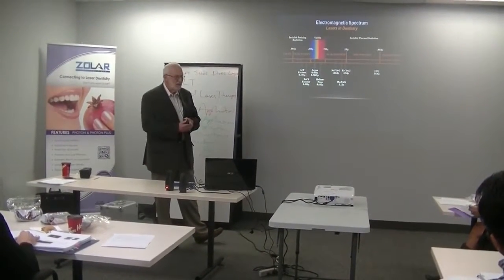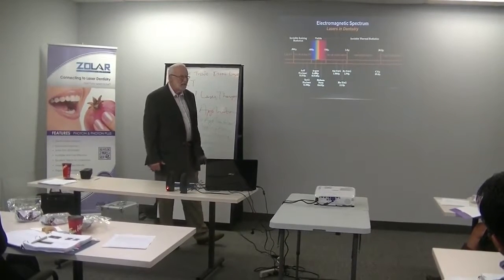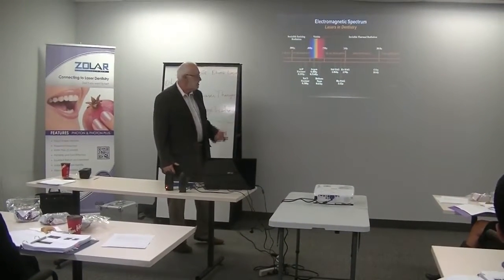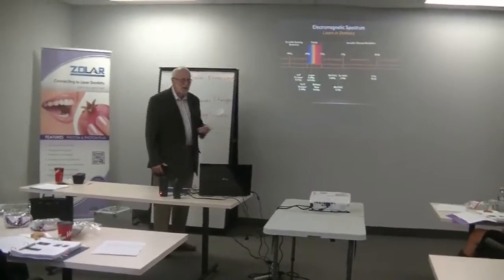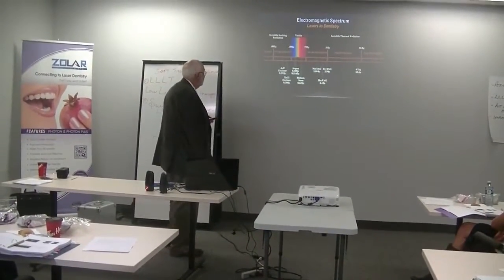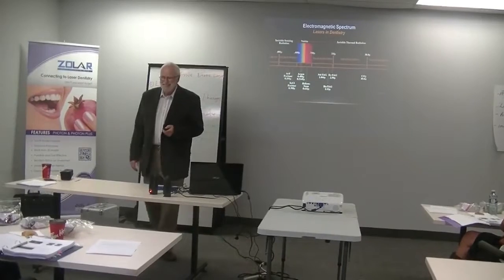So if you just had the laser, you wouldn't actually see anything. So you have a red beam in it that shows you where you're going. But it's a very low power beam. It's basically about the same power as this laser pointer. And you can buy these much more powerful, and this is where all the problems are running into. People shine them at pilots in the sky. The more the energy, the more damage it can do. Then you've got the far infrared, where you get your carbon dioxide lasers, which you saw last week.